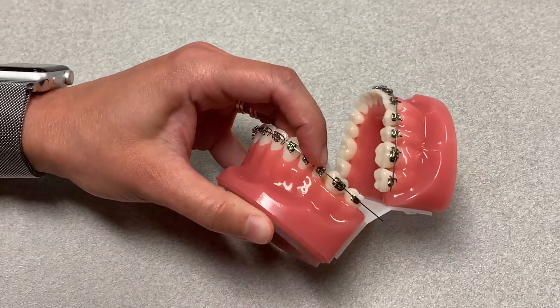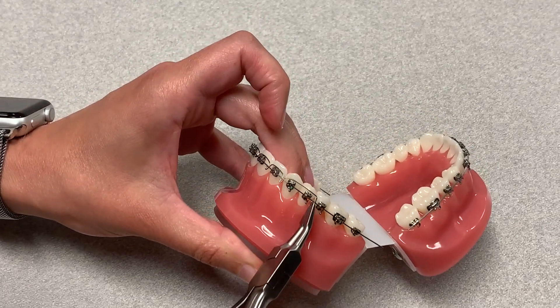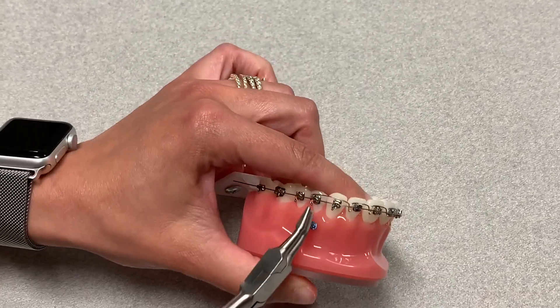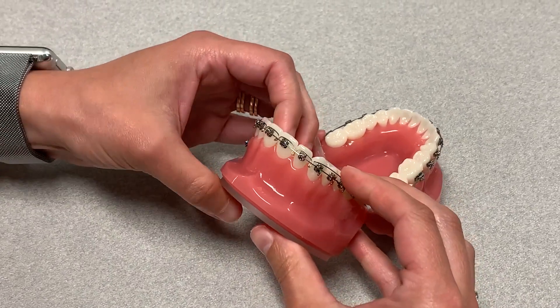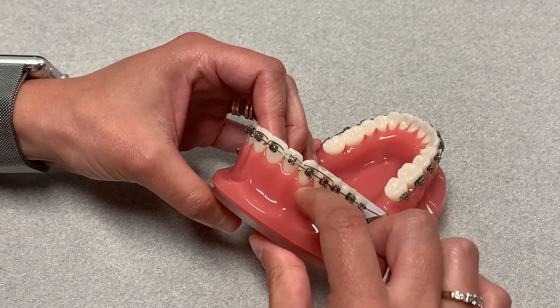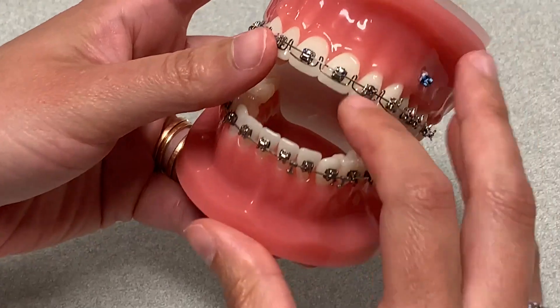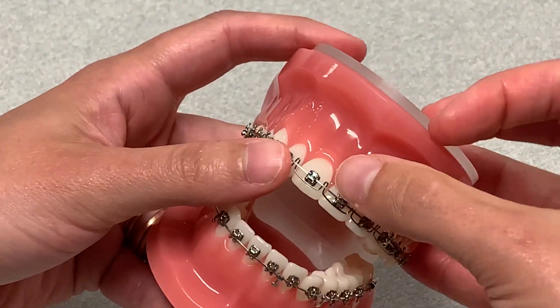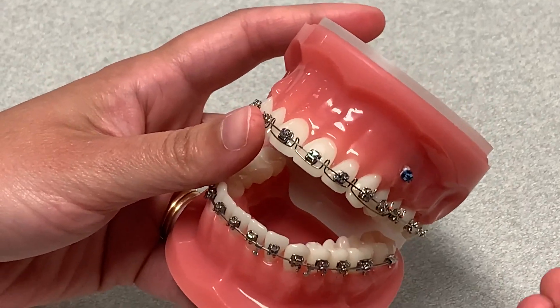Now you would go through and crimp here and crimp the other side. Another thing that a lot of users do is steel ligate this on the cuspid, because as you can see, if a patient is chewing something hard and pushes here, this whole thing would unwind. That just helps to avoid emergency appointments.